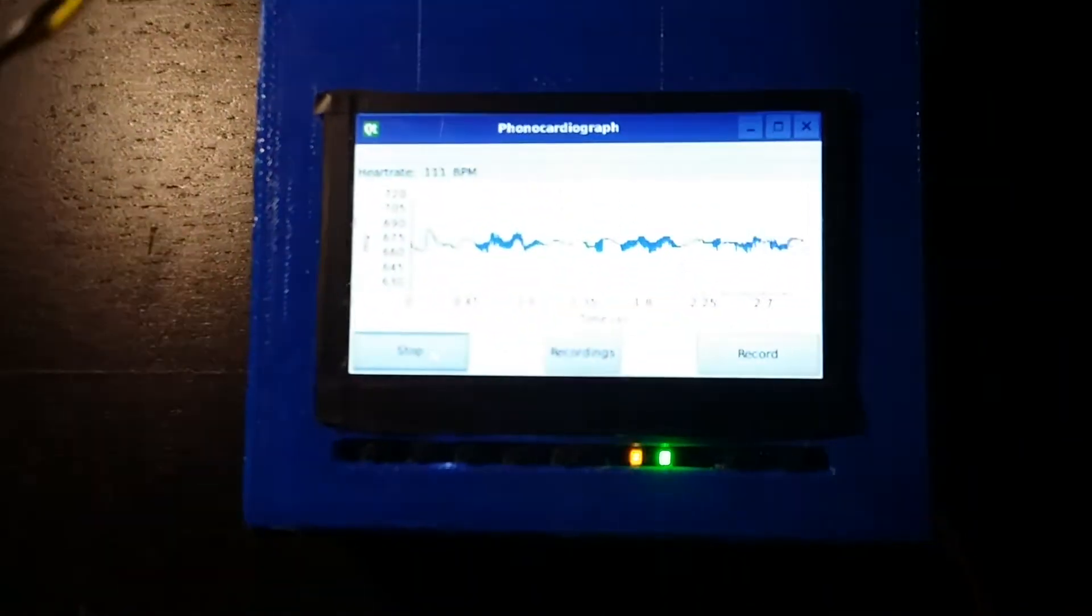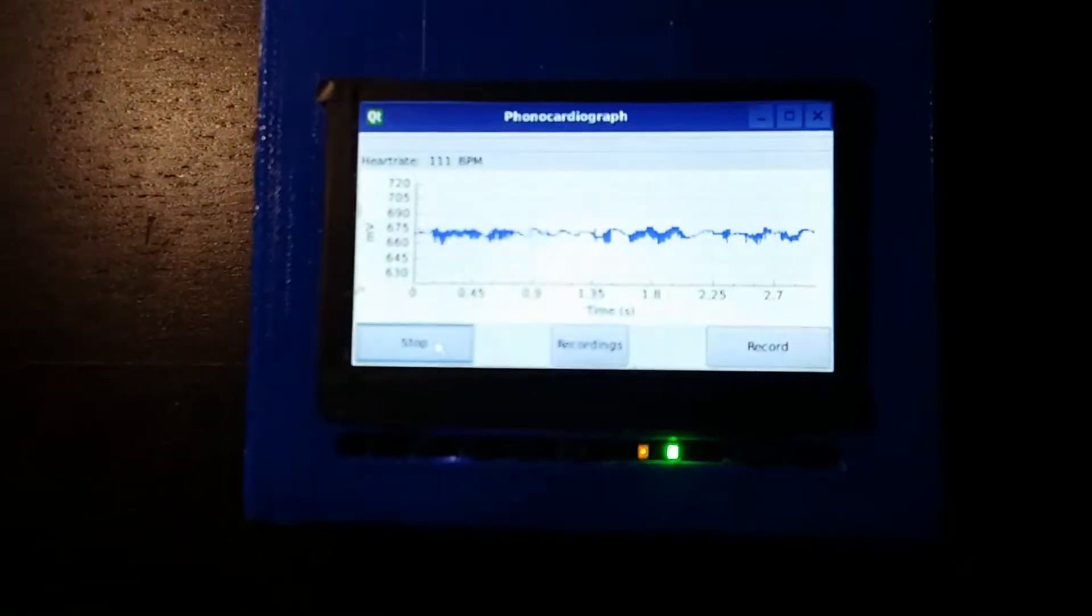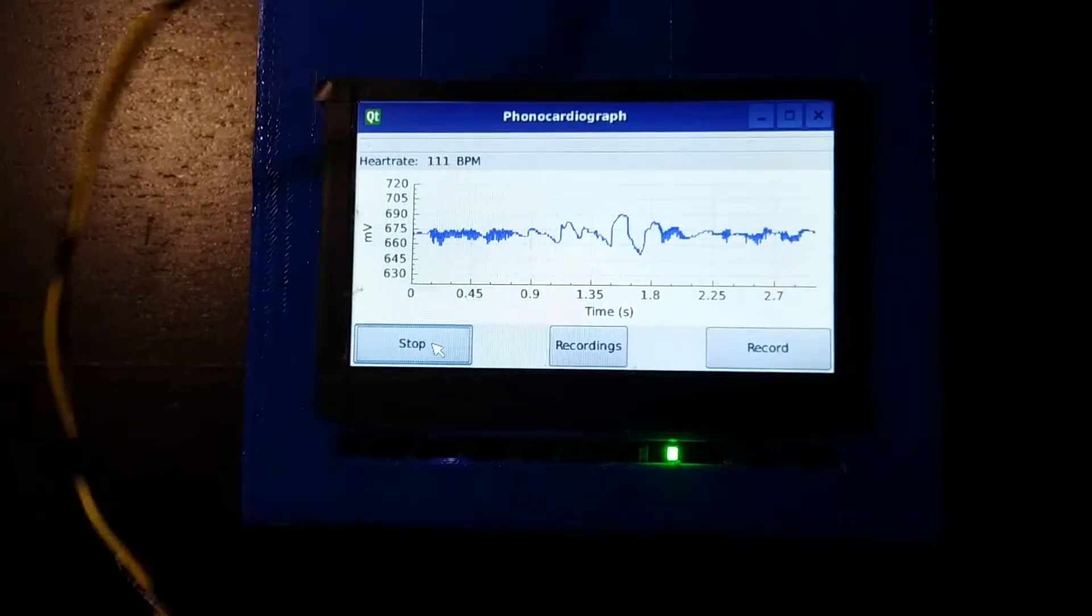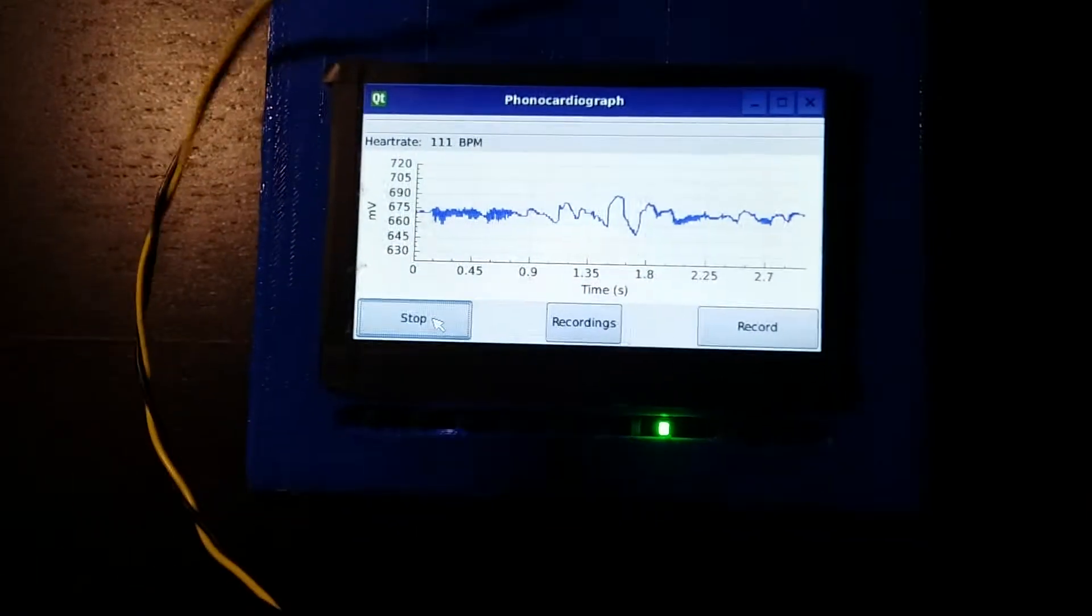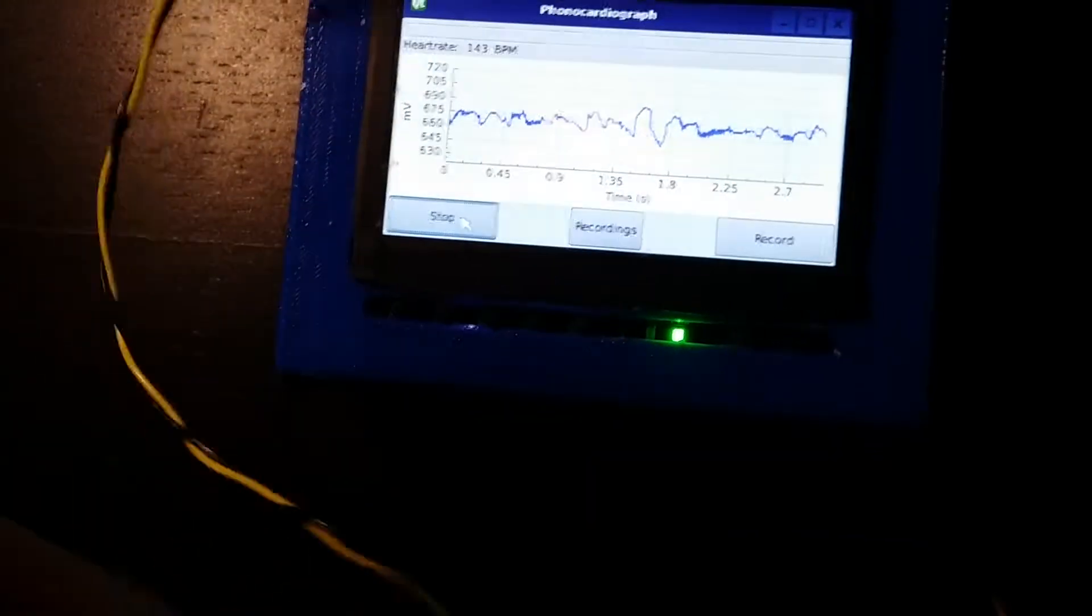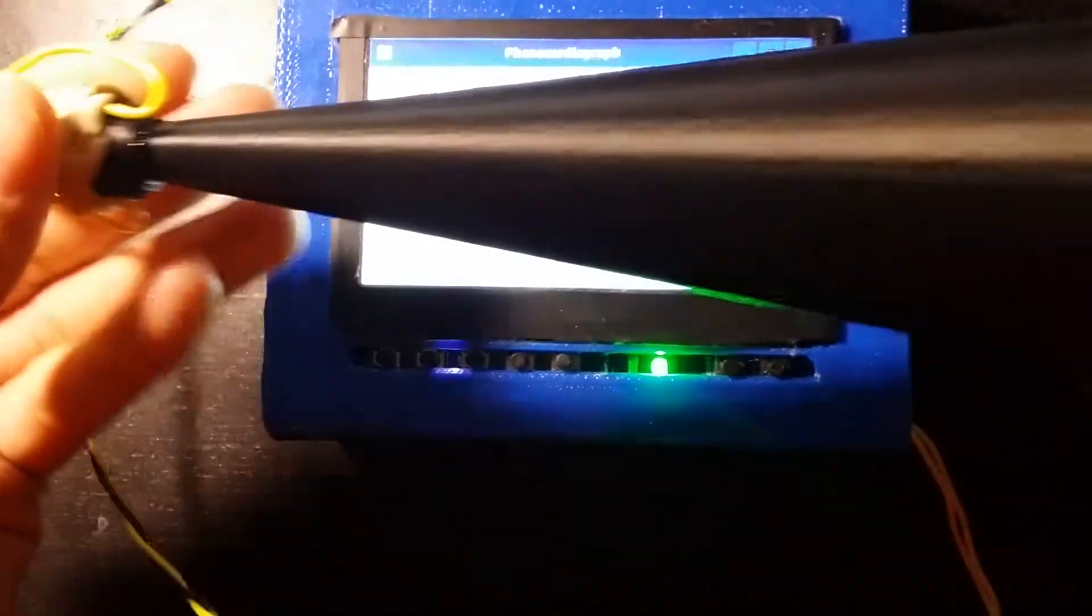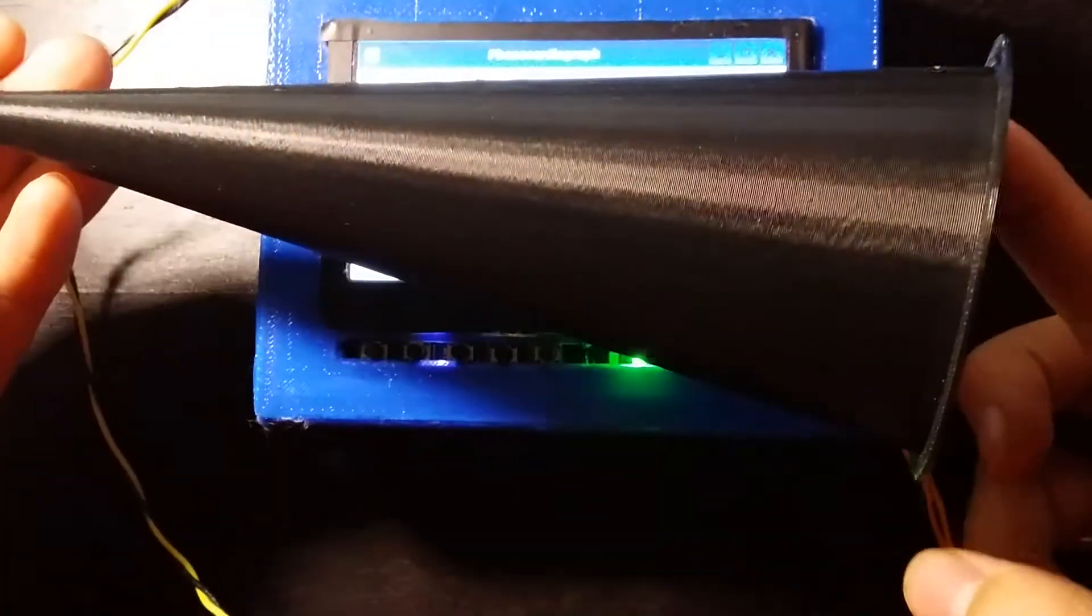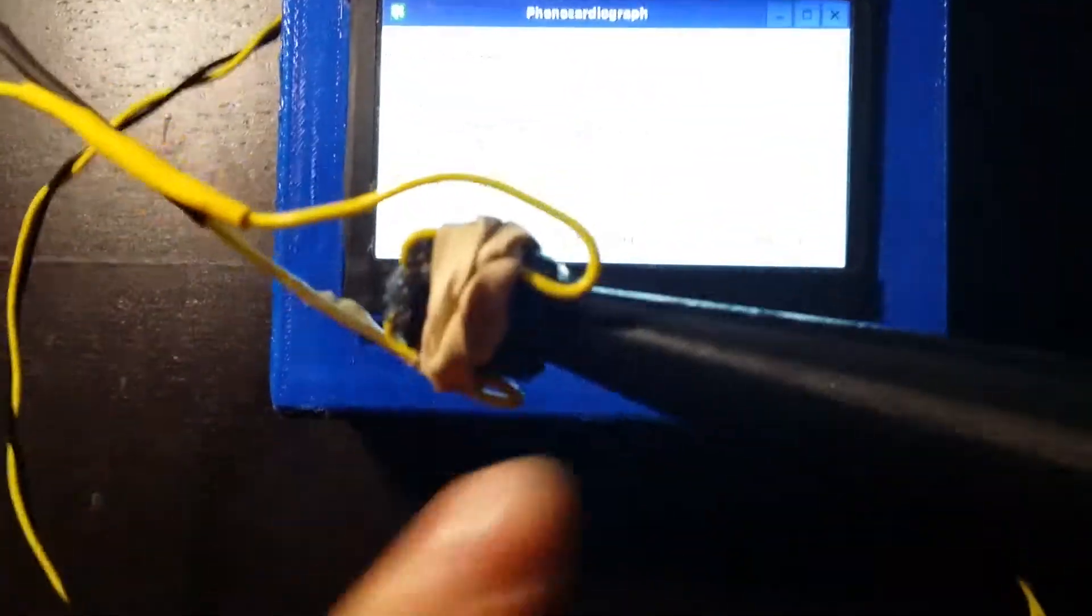If I put this on my heart, the inverted horn that we designed with the microphone here and opening here, you can see my heart.